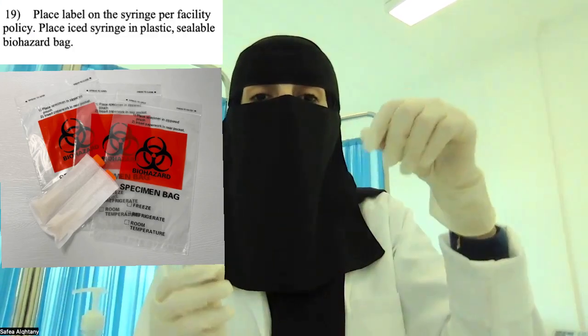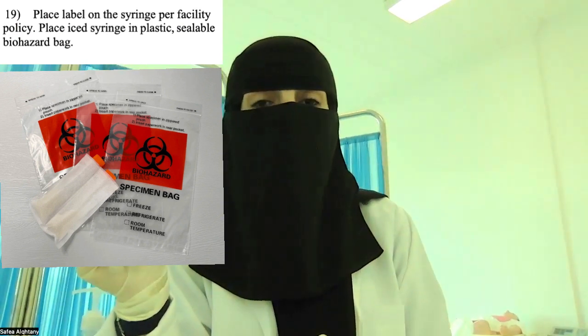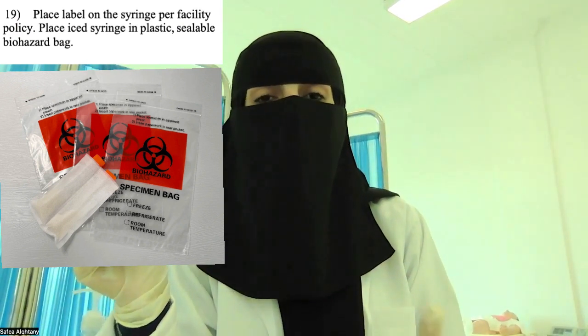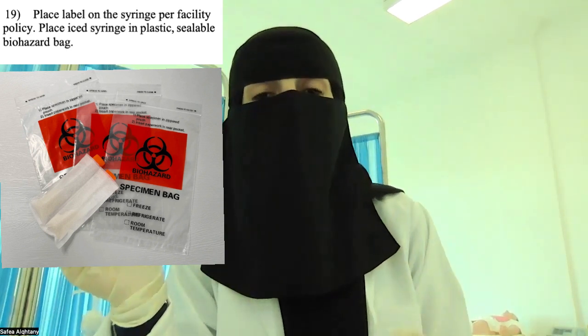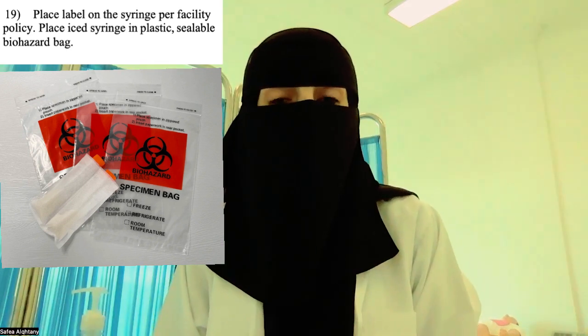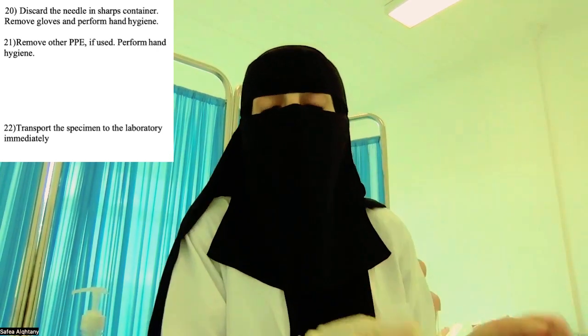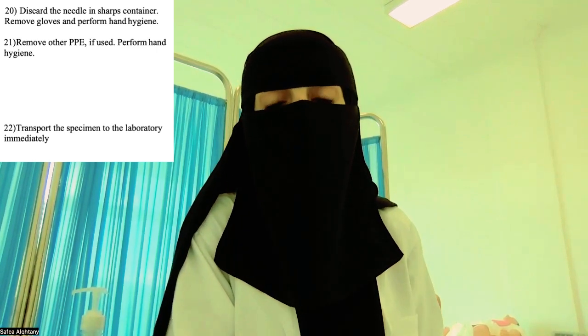Then I need to take the sample again and check the sample, place the sample label with the sample itself in a biohazard or sealable biohazard bag اللي هي أكياس المختبر, and then send it to the lab for analysis later, okay? But not more than 10 to 15 minutes. After that, I need to place the patient in a comfortable position, remove all the equipment, raise the side rail and lower the bed to comfortable position, remove all the personal protective equipment and gloves, and perform hand hygiene.